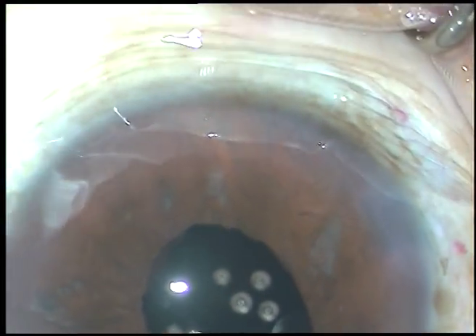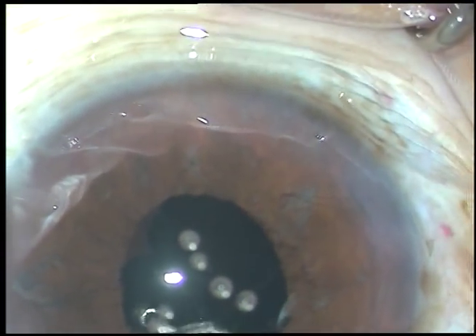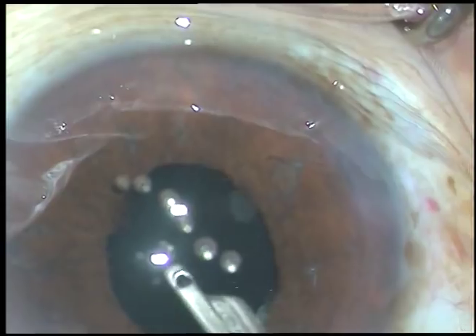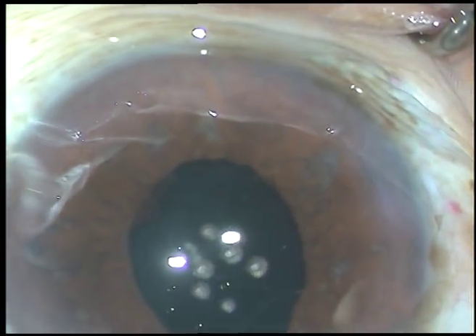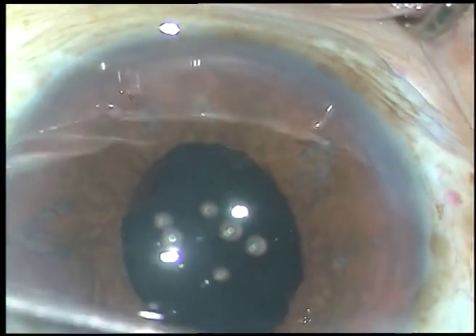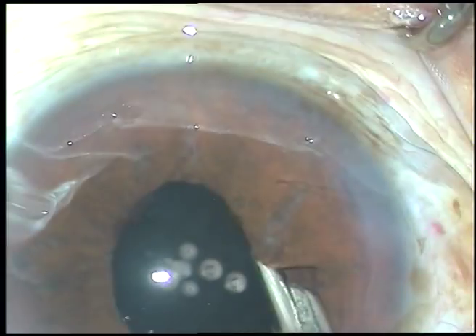In earlier days there was a manipulator and one could find it cumbersome — I myself found it cumbersome. But now with this 23-gauge crocodile forceps it is really easy. It is also cheaper than other pupil expanders and can go through a 0.8 or even 0.5 mm incision.